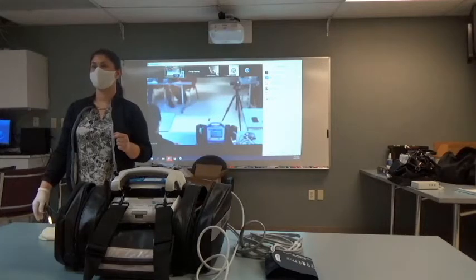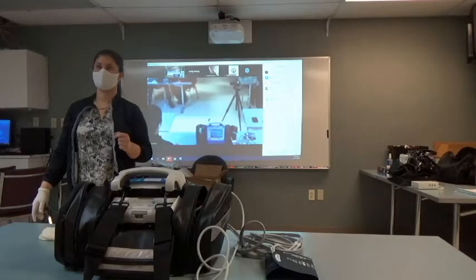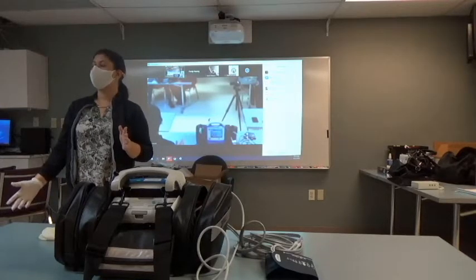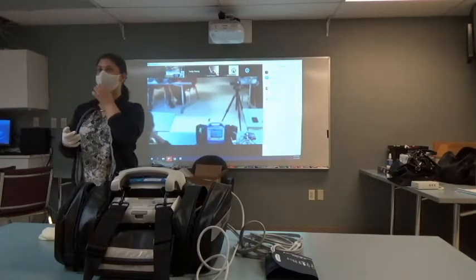So I think I would like it programmed to be every 5 minutes, assuming that we're going to get a blood pressure cuff on a majority of our patients 99% of the time within that first 5 minutes, exceptions maybe DOAs and cardiac arrests. Okay. We can do that ourselves though, right? Well, with your permission, I'll program it to power on in automatic mode.